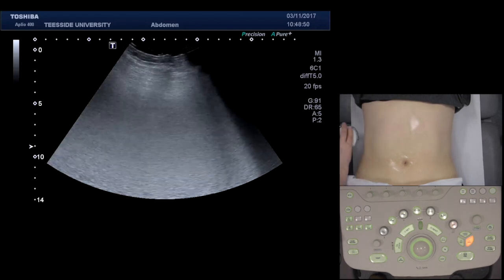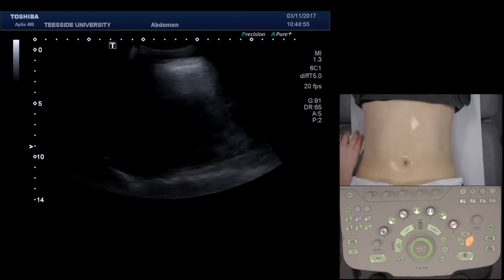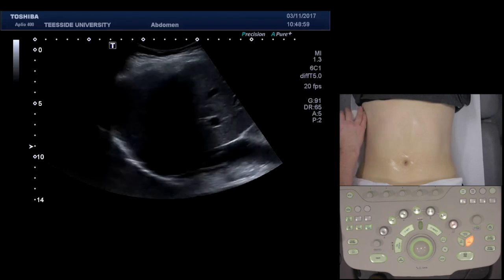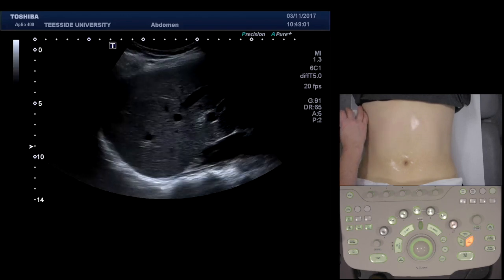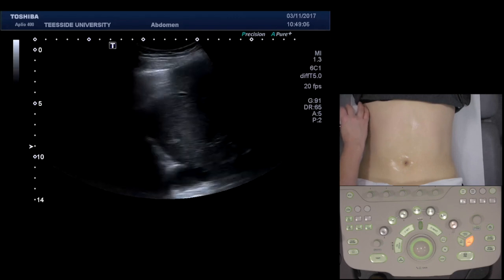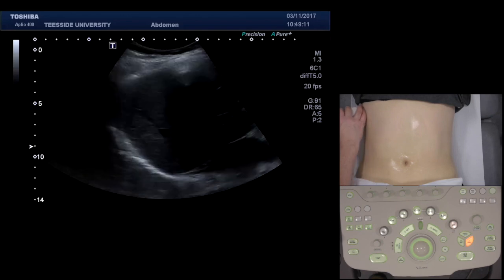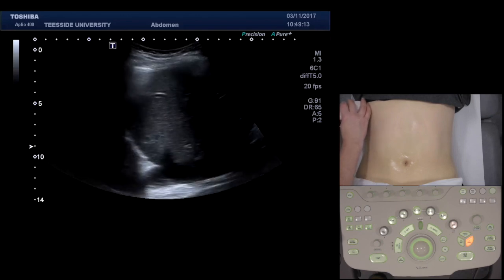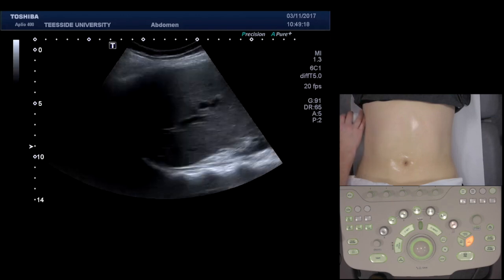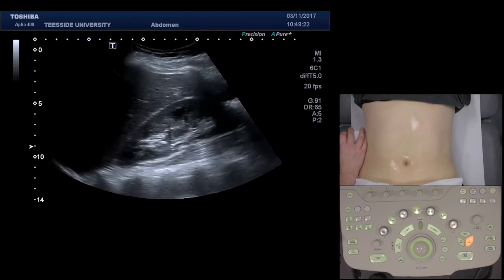I'm going to look at the kidney, and what I'm doing now, this is helping me do two things. One, I'm scanning the liver intercostally. So all the parts of the liver that were in the far field when I was scanning subcostal are now in the near field. As you can see, I'm going up and down the rib spaces, and this is just a different angle to look at the actual liver, and I'm moving the probe up and down, up through the various rib spaces, and I can see the right kidney.